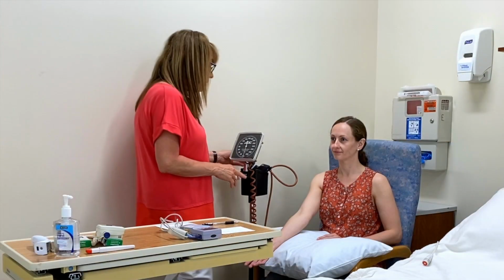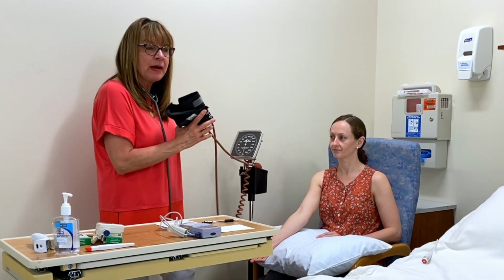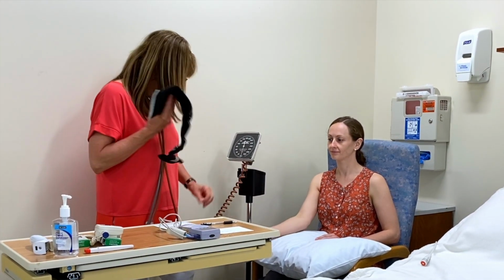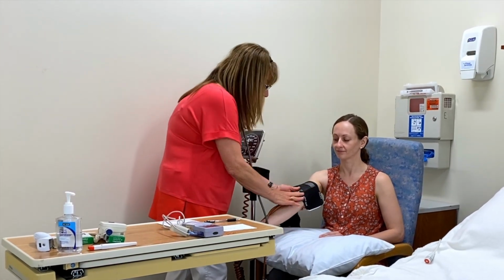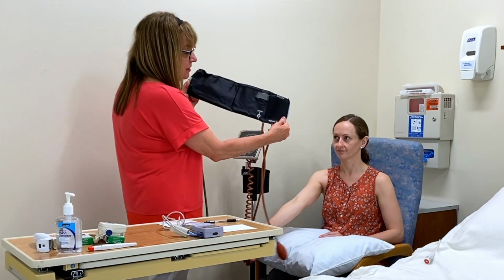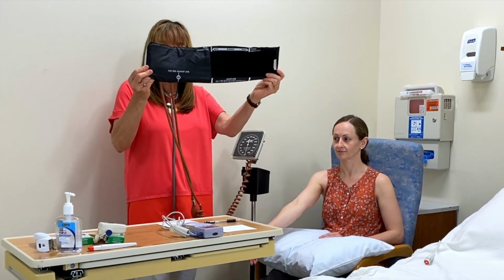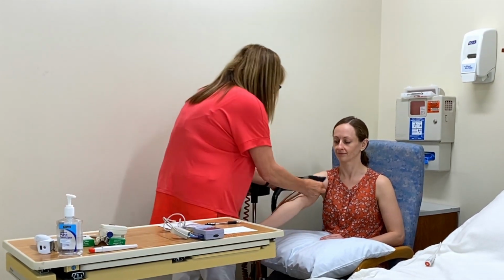When you palpate a blood pressure, typically when a person's in crisis, you may only get the systolic or top reading. And when you palpate a blood pressure, you're only going to get the top reading, the maximum amount of force that is exerted against the wall of the artery. Systole. Remember, when you put this cuff on, it says here artery, and then inside it says this against the patient. So that way you'll get it in the right direction.